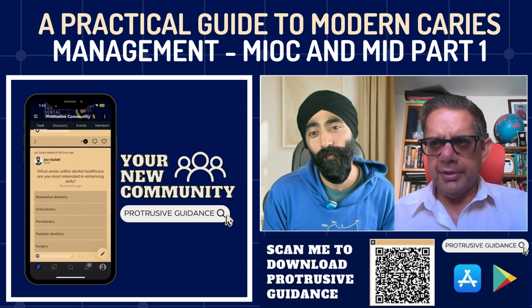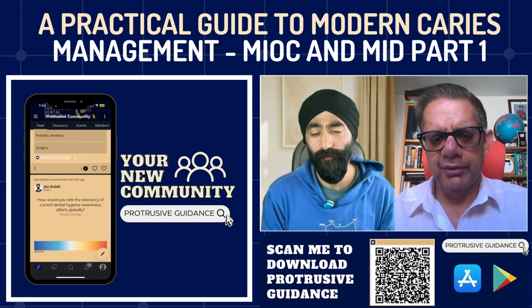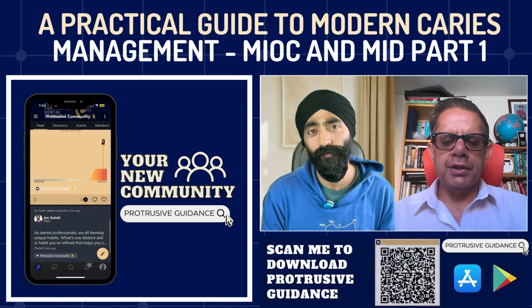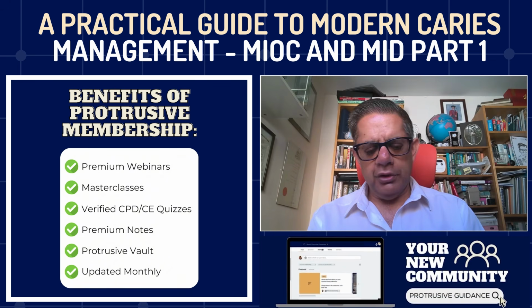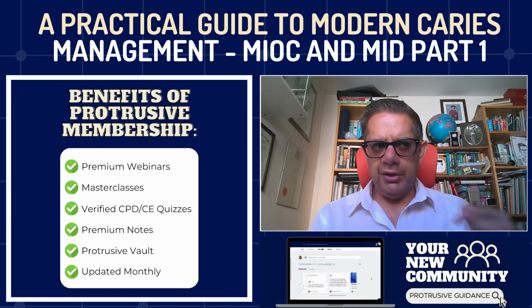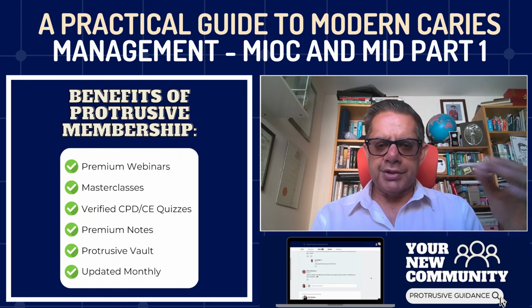Absolutely. So you're going to do a little bit of reading about it, because there will be publications, there will be writing on that that's been done properly. But what people also forget is you've got the kit. So you start to calibrate yourself. If you're going to use it for caries diagnosis or white spot lesion diagnosis, find some patients where you can clearly see the white spot. Then zap it with your scanner and start to build up.